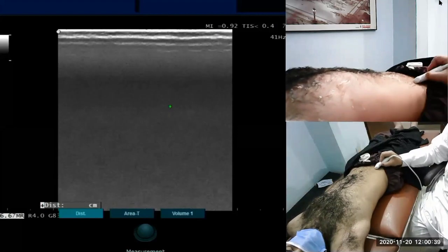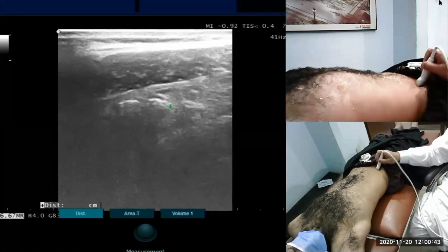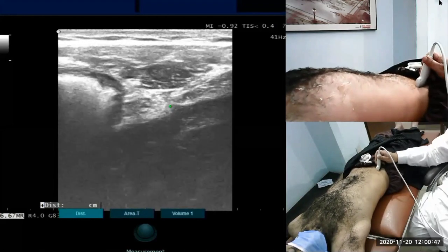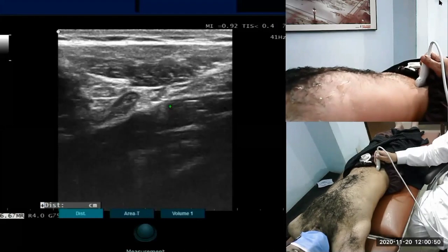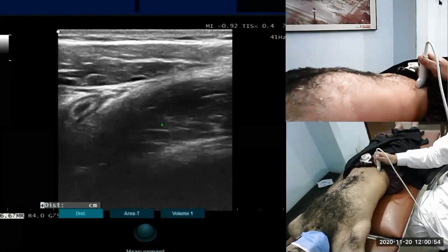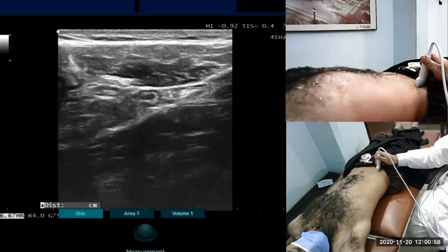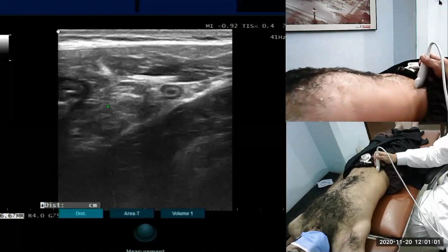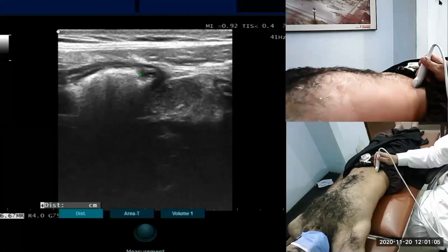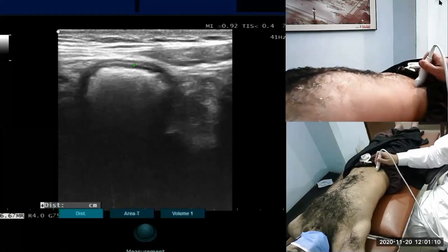In the right iliac fossa, we go now to see any free fluid. This is the iliopsoas muscle. This is the anterior abdominal wall. And there you see intestinal loops with food particles, white food particles inside, the same layers over there.